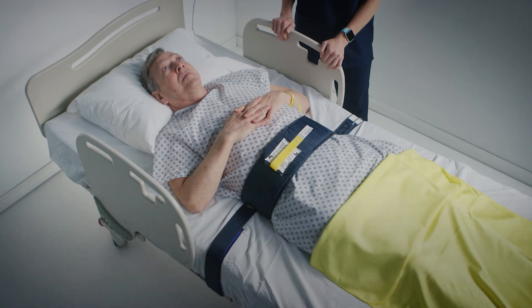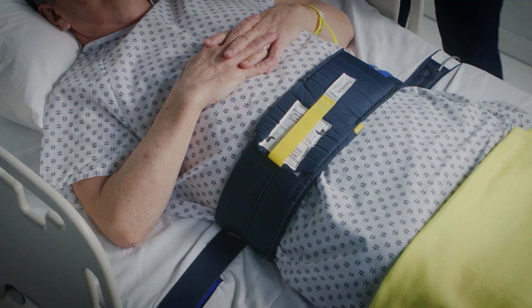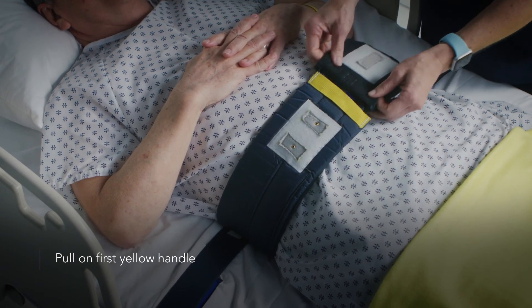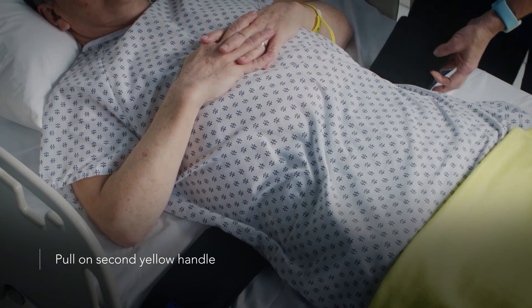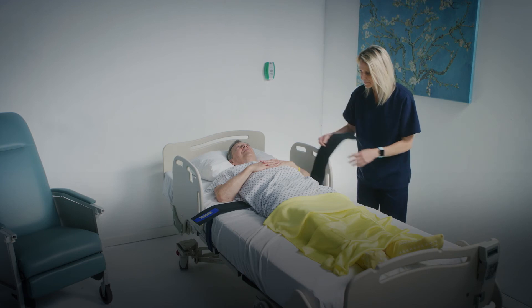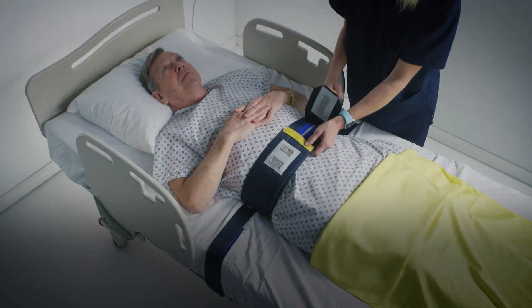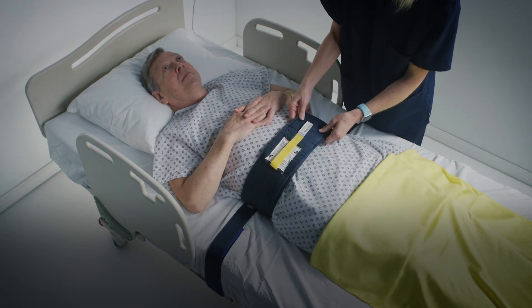Now we'll review how to release the Head Start Bed Sensor from the patient. Pull on the first yellow handle to disconnect the white velcro. Pull on the second yellow handle to disconnect the blue velcro and release the sensor. To resume monitoring, reconnect the blue velcro and then reconnect the white velcro. Squeeze firmly to ensure proper device function.